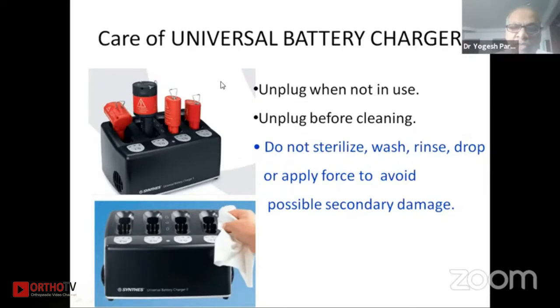To take care of the chargers: keep it unplugged when not in use, don't keep it plugged in all the time, and unplug before cleaning. Do not sterilize, wash, rinse, drop, or apply force to the charger to avoid possible secondary damage. Be very careful while inserting batteries inside and clean only with a very soft cloth so there are no scratches.